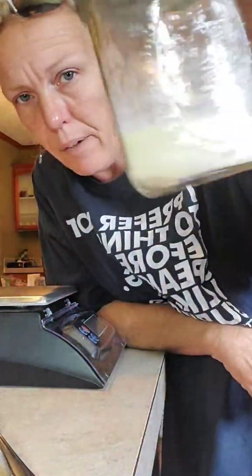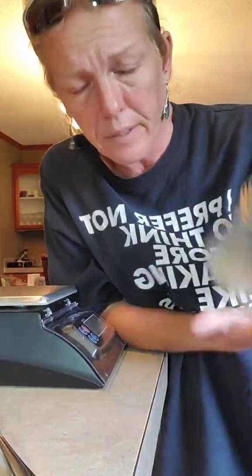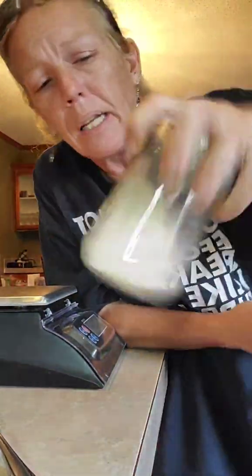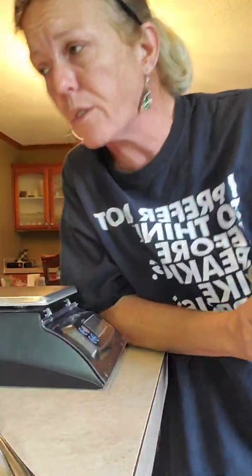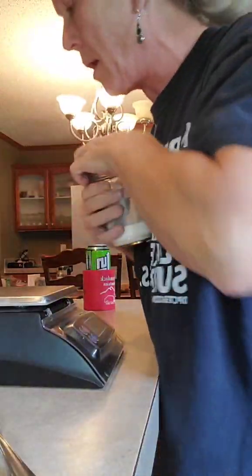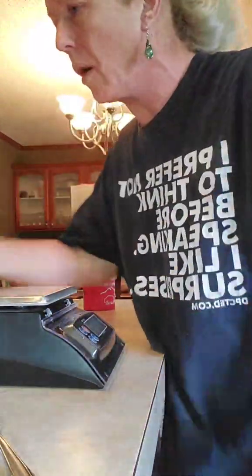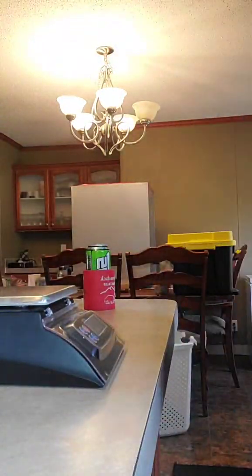Now, that's not a lot of powder. That'll run a lot of product, a lot of plates. But it's not a hell of a lot of powder for 1,000 milliliters of water. I'm going to go grab my 1,000 milliliters of water out of my pot because it's hot, hot water. I didn't really even need these. I just grabbed them just in case.